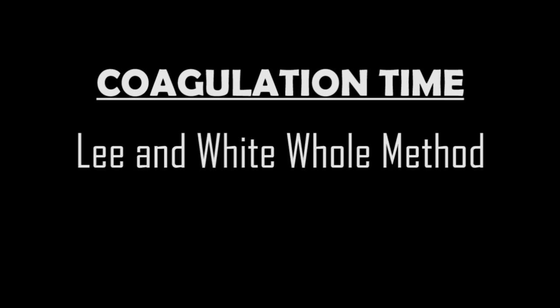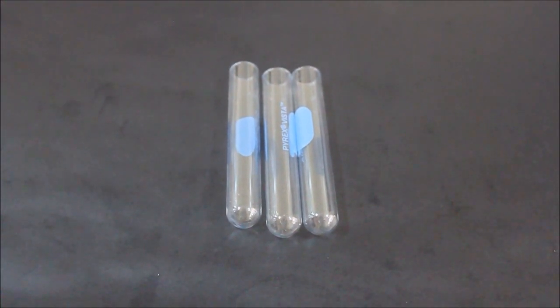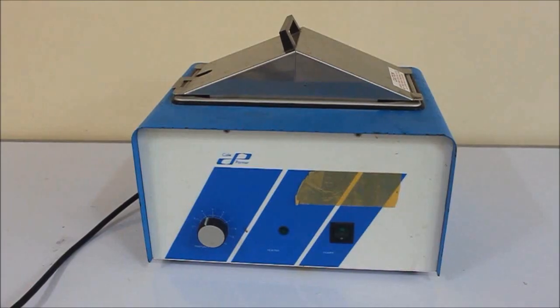Coagulation time is the time required for whole blood to clot. Some materials needed for the Lee and White method are three 5 mL glass test tubes, disposable syringe with needle, timer, and water bath.